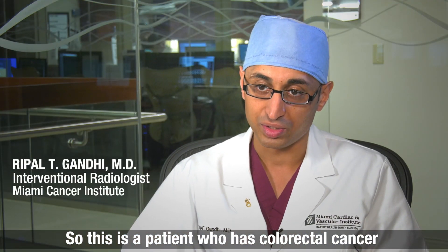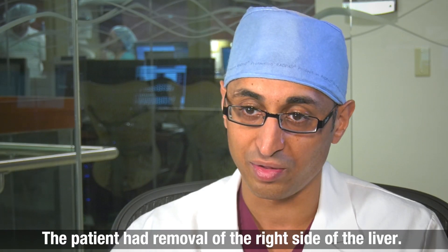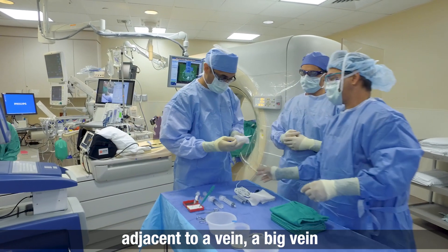This is a patient who has colorectal cancer, metastatic disease to the liver. The patient had removal of the right side of the liver. There is still one residual tumor left in the left side of the liver, and this tumor happens to be adjacent to a big vein.